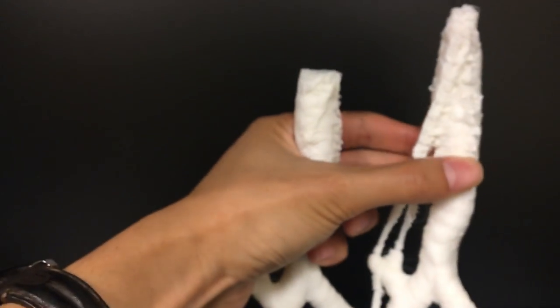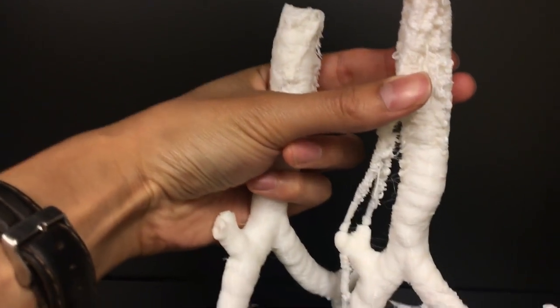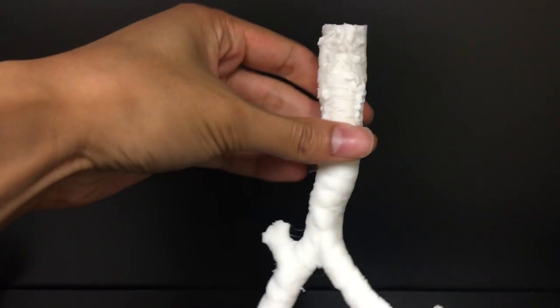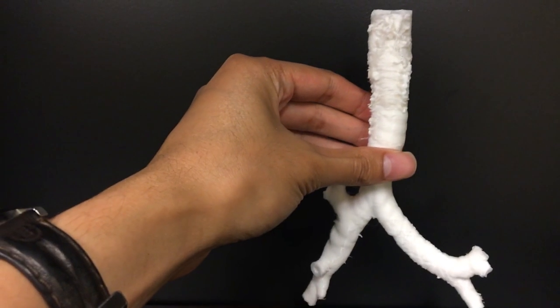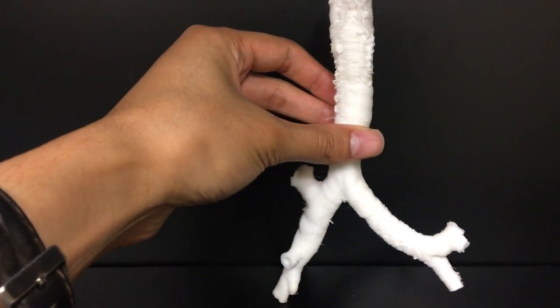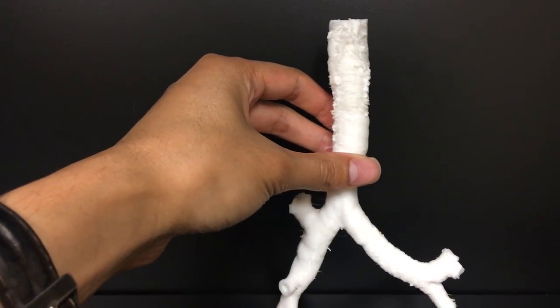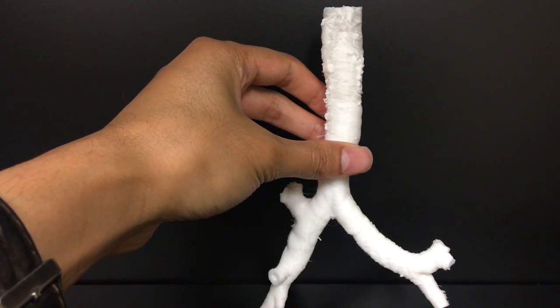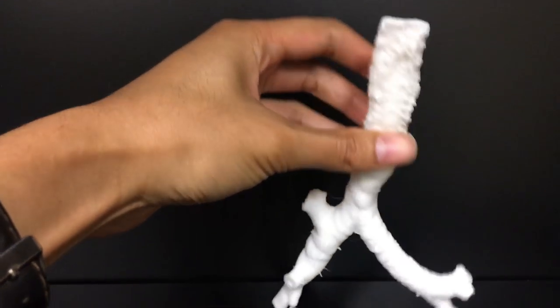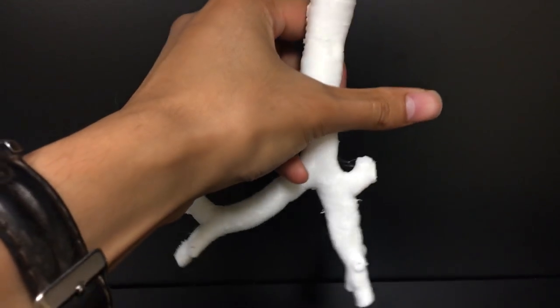As you can see, this model is shorter than the other one. I swear this is kind of exaggerated cuts. Yeah, it's missing like a centimeter from the top just to widen the bore a little bit. If you don't want to do that, then I would go back into your 3D model and try and give the hollowing a little. You're going to try and make your offset for your hollow less than 2 millimeters in that case, like 1 millimeter, and it'll give you a wider opening just naturally. But again, it's much cleaner now.